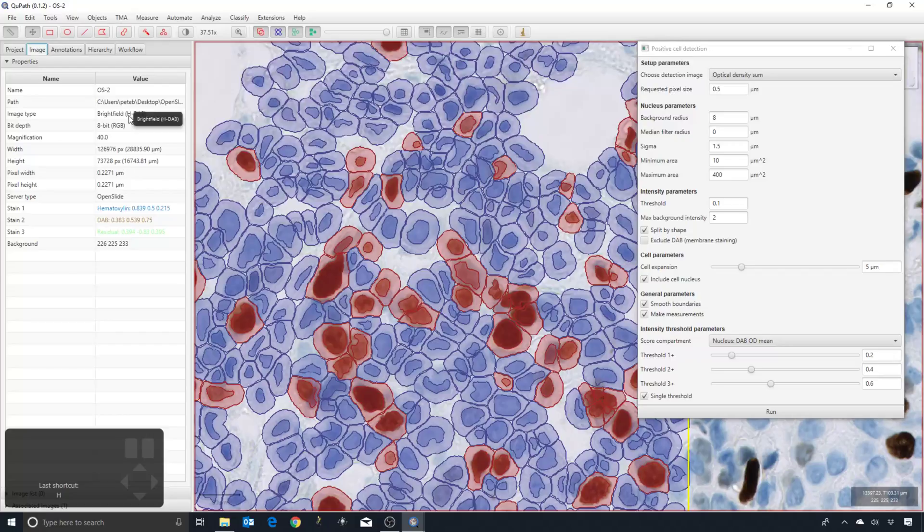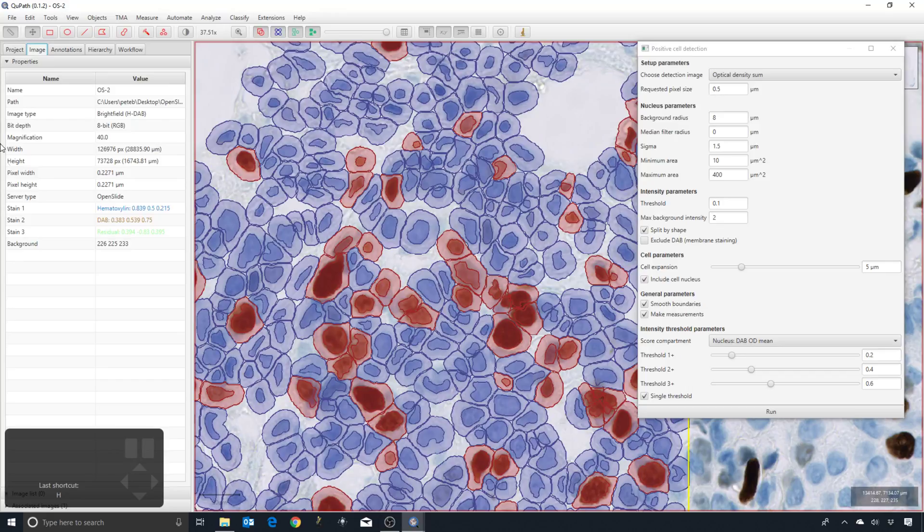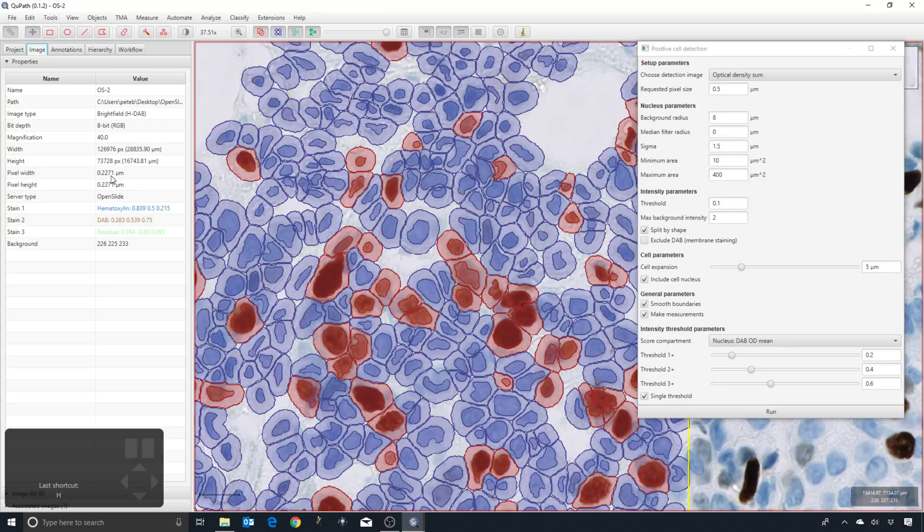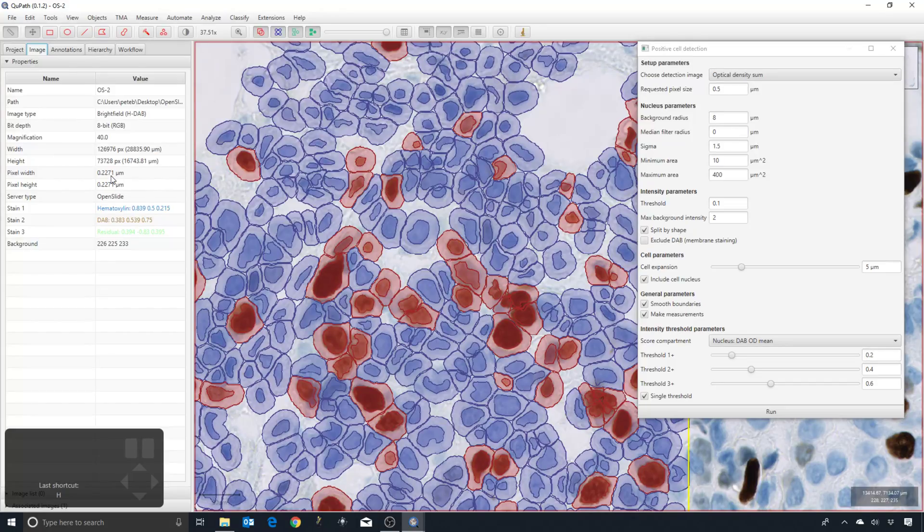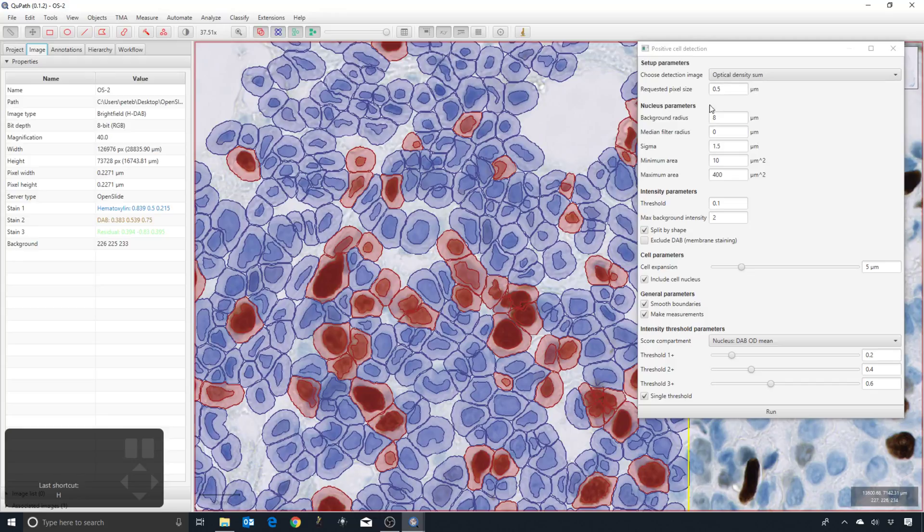The requested pixel size is 0.5. The actual pixel size in the image is about 0.2271, so that suggests it will downsample the image by probably a factor of two or thereabouts, because QuPath is trying to create an image where the pixel size is somewhere around 0.5.